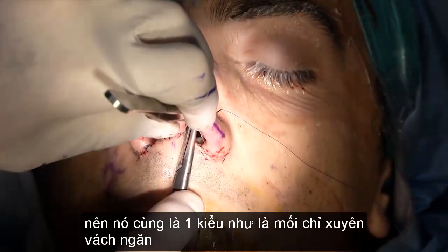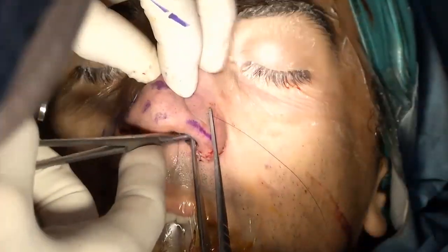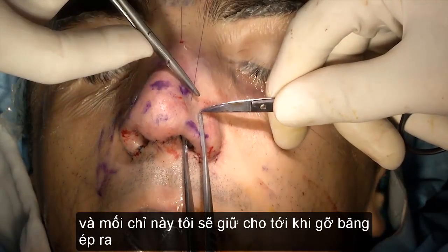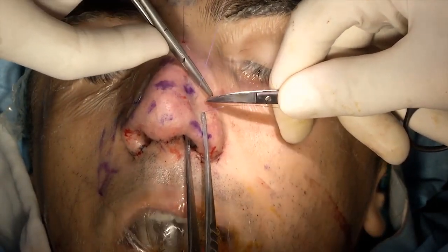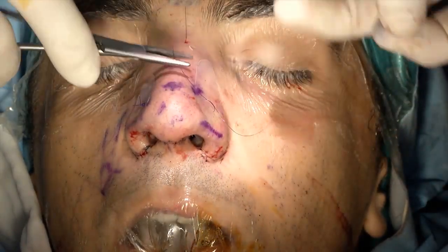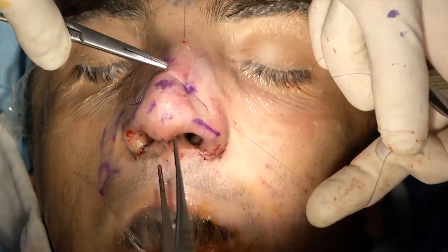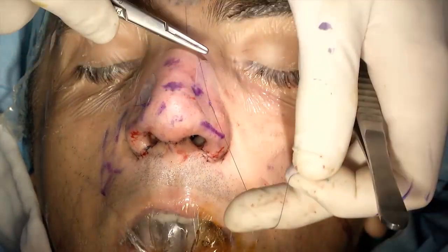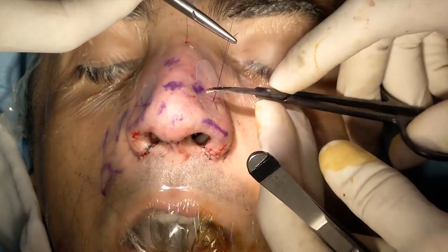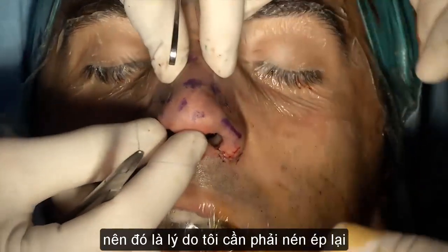So it's the same concept as the septal transfixion suture, and that's it. So these things are kept until the steri-strips and the plastic splint come off, which is 7 days, of course. So see the reason I just have selective compression.